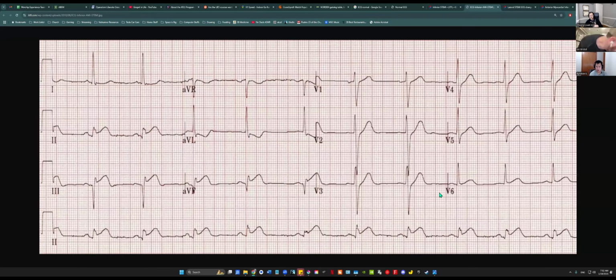I thought that at the start of the ST segment, at the end of the QRS, it's a little bit lower. That's why I thought, even though it looks like an elevation, it just started low. If you let this go, V5 will start pushing up more. Okay, all right, good. So this is definitely an ST depression in AVL.